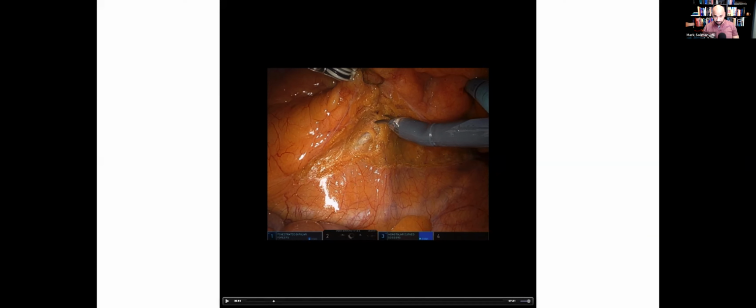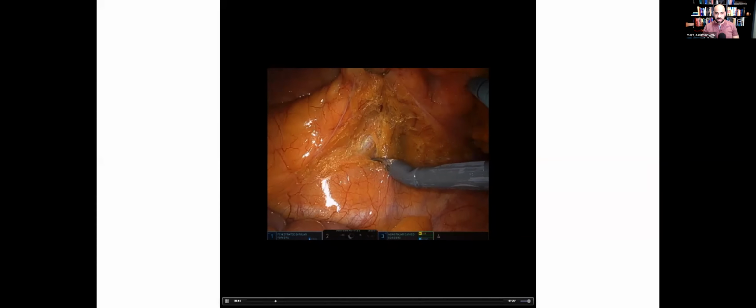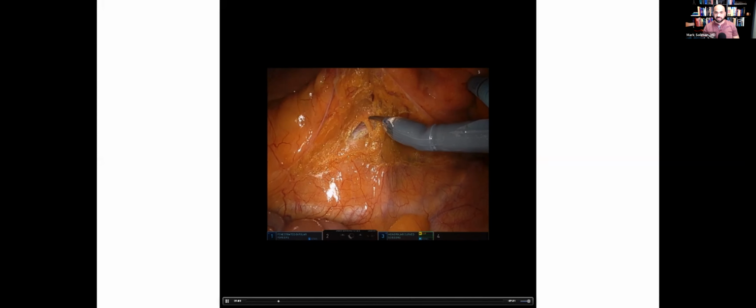what the surgeon does is he clearly realizes that is too deep. So what does he do? He just backs up and then readjusts the plane to get into the correct embryological location. And that's exactly what I would do in any single operation. He's doing a good job checking to make sure that vessel's okay, but that's exactly the way to do it.